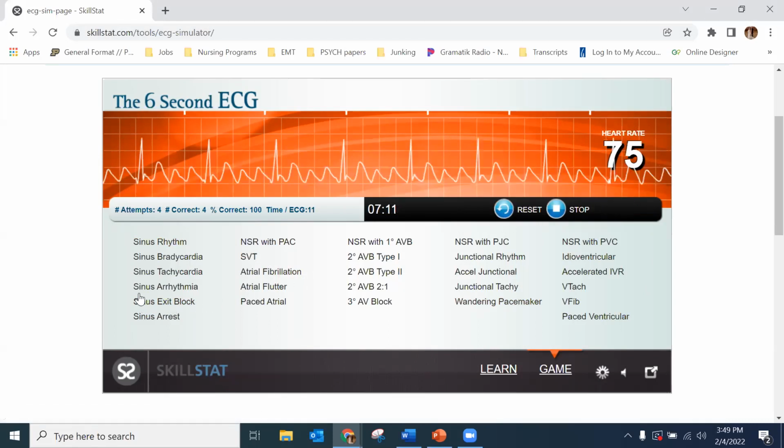That's your flutter. I don't know who said a flutter last time. It did look like a nice AFib, but it wasn't quite that flutter. So your flutters look a little bit prettier. I can definitely see it. I saw sawtooths in the other one, but once you corrected me, I realized, oh yeah, here it's regular. So thank you. I personally think an AFib strip is going to look worse than that last one did. But when you see a flutter, you're like, oh, that's a flutter. You're going to know it.